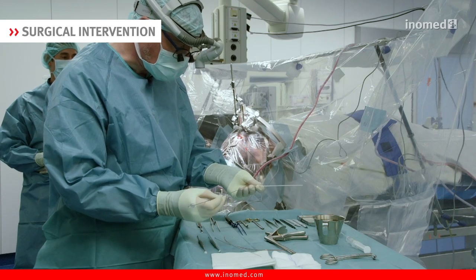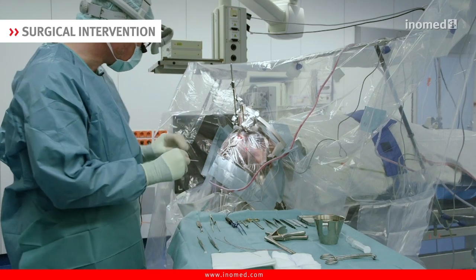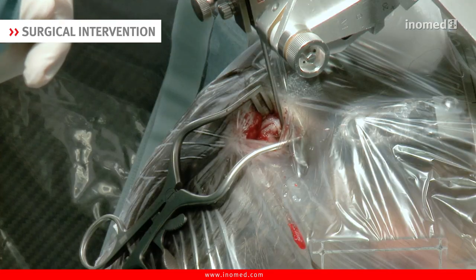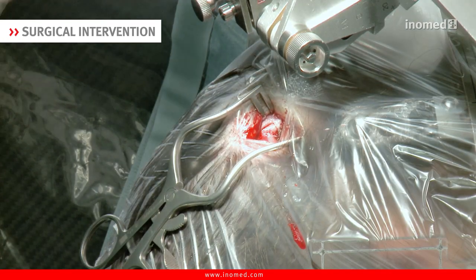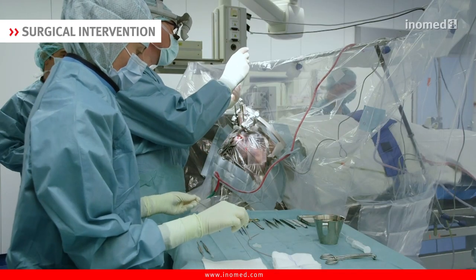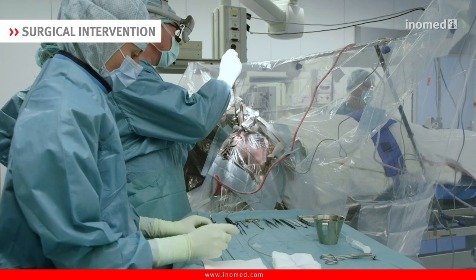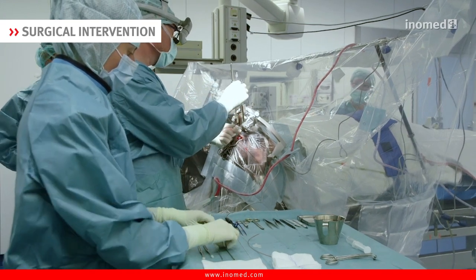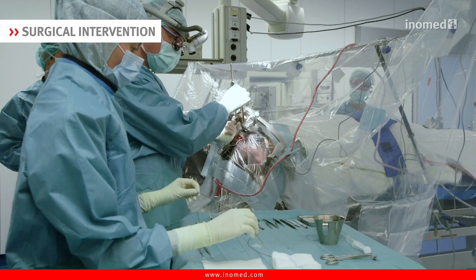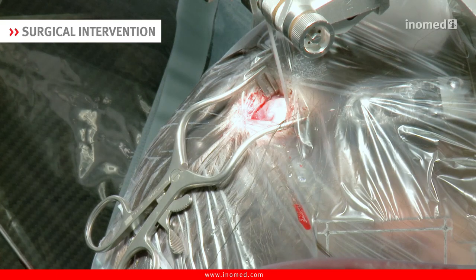And this is the mandarin. Now I am going to remove the Backlund biopsy probe. The Backlund probe will be removed, and now I will guide the seed catheter as planned and as set up on the phantom into the depth here. Here too, we have to ascertain that there will be no deviation.